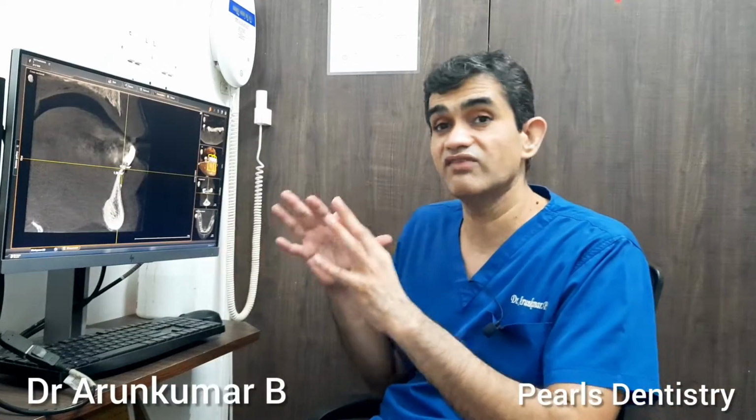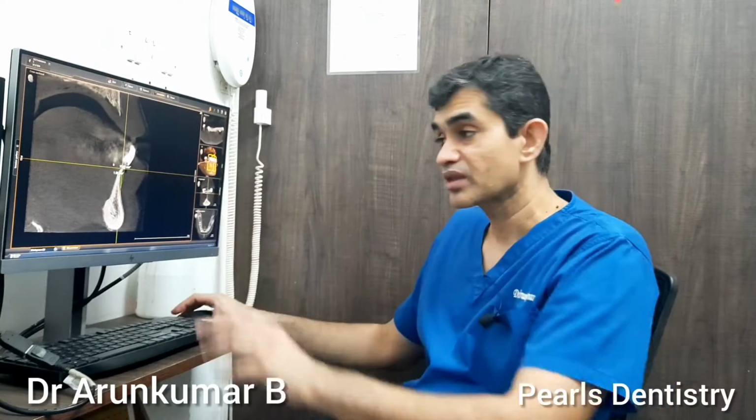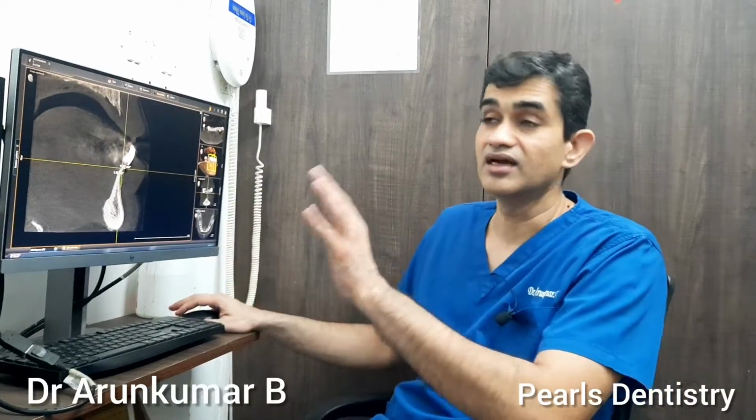This is very vital information which a CT provides, because when you look at the X-ray alone, it looks like this area has got a lot of bone. But actually when we take a CT scan, we see that there is no bone. We won't be able to do implants here. So that's the importance of taking a CT scan.